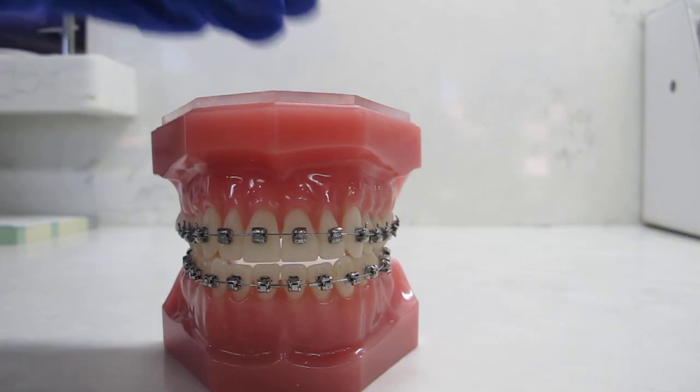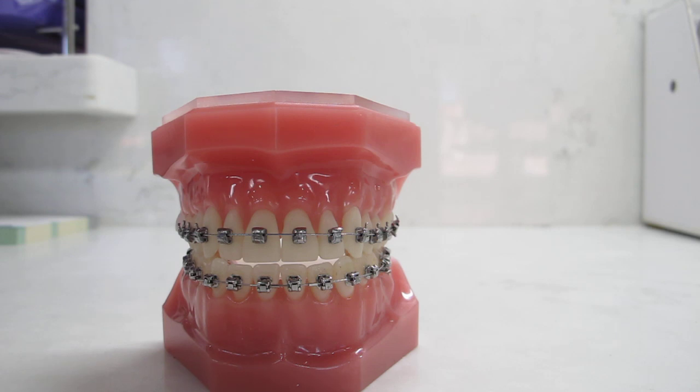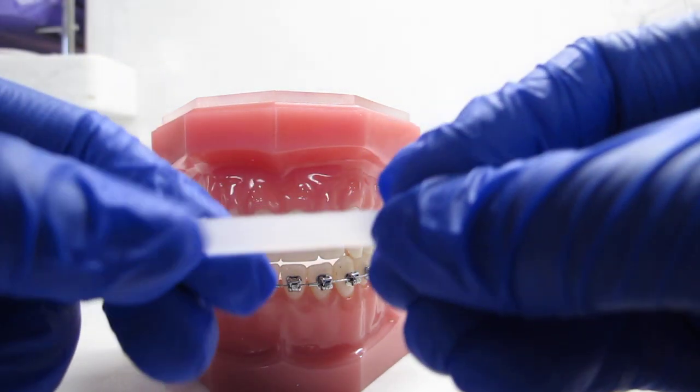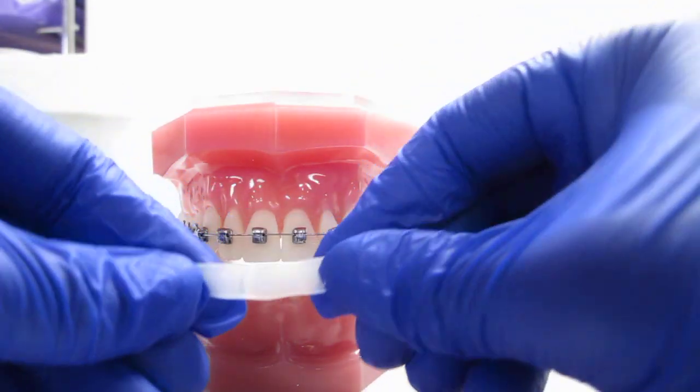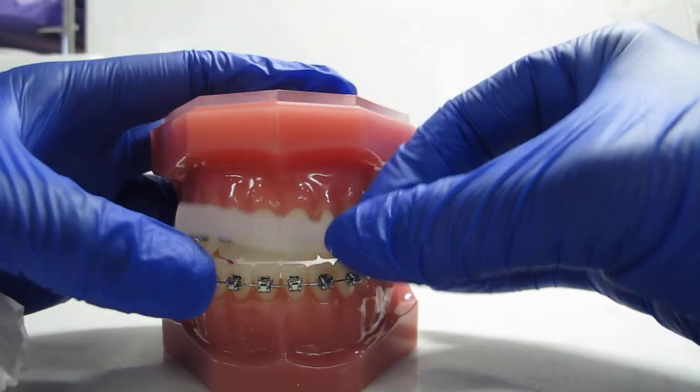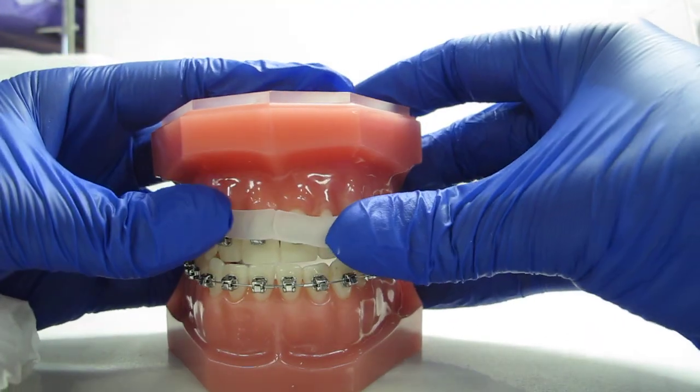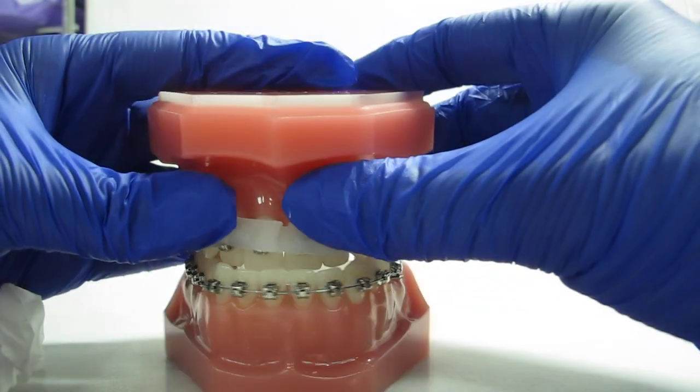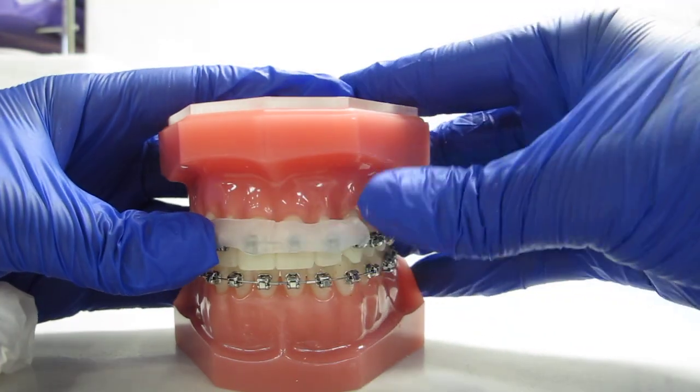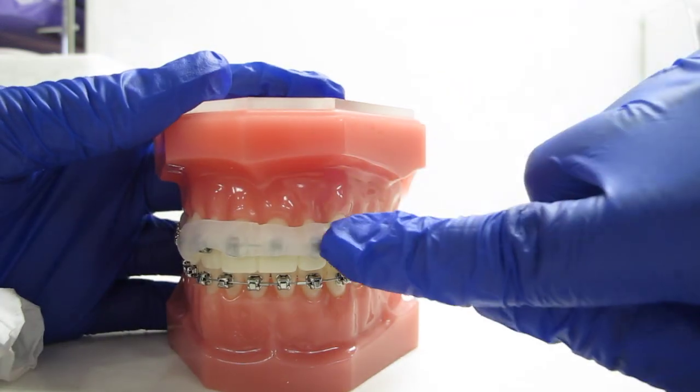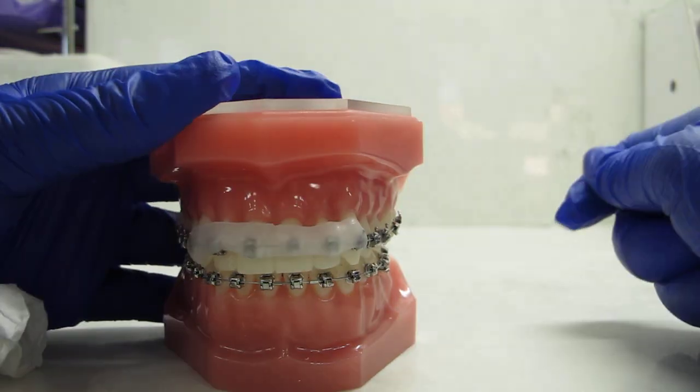You can also take an entire stick of wax for bedtime your first couple of nights to get used to the brackets if needed. Warm it between your fingers, place it on whatever is bothering you, so it's now a cushion while you sleep.